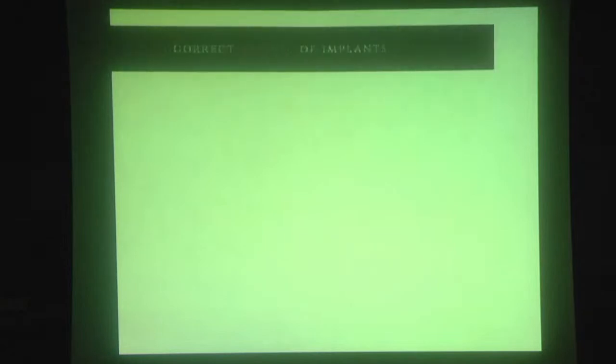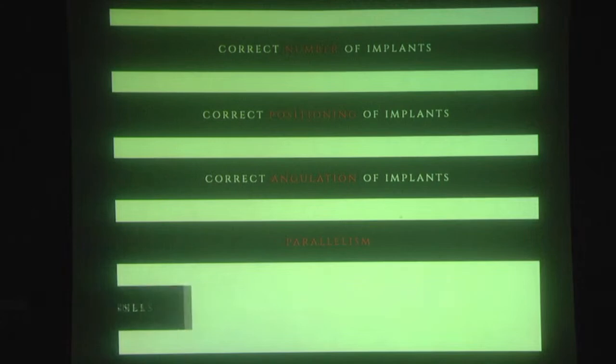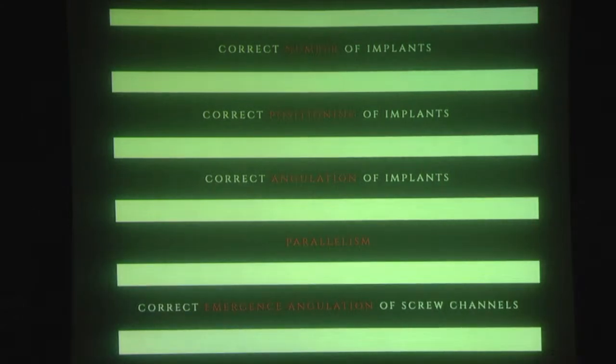In fact, I didn't do that. The guide did the operation. I just planned. With the guided operation, we think that we are good doctors. No, the good one is the guide.